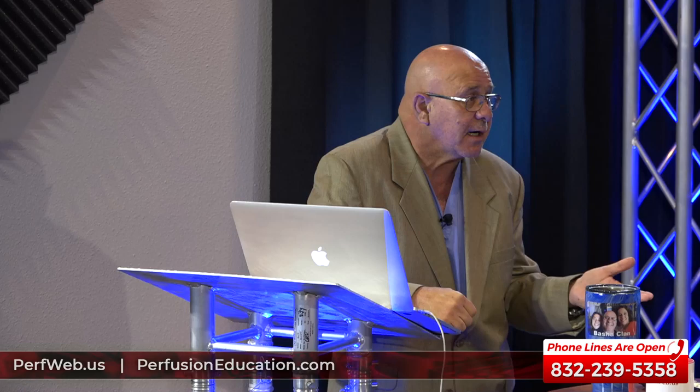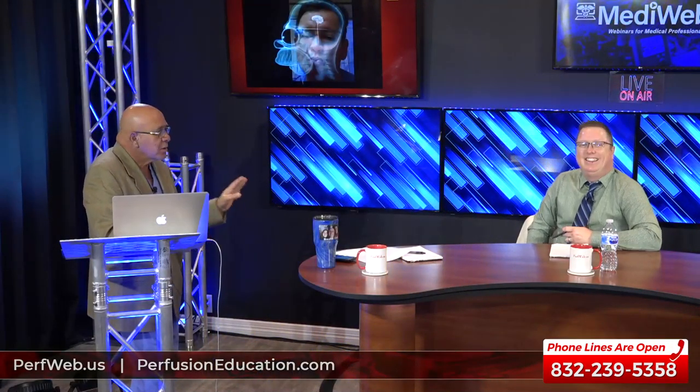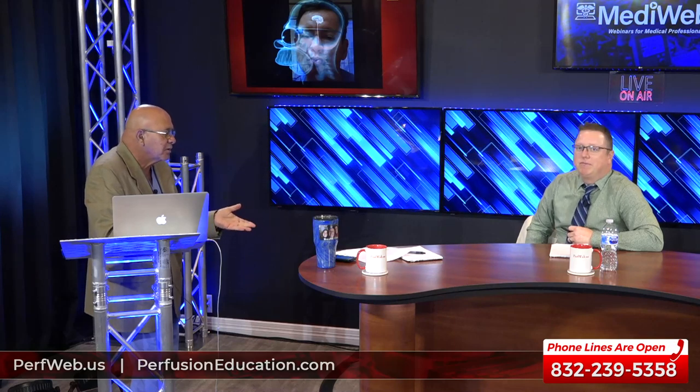No, let's talk about that now. So you went down the rabbit hole, so let's just go down the rabbit hole. It makes no sense to me whatsoever to leave it on. Even if you lost a couple of hundred cc's, you're never going to get it back from the pump, and you're running the risk of clotting your pump off. Just use the Cell Saver.